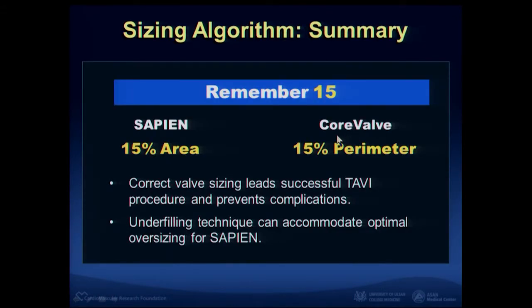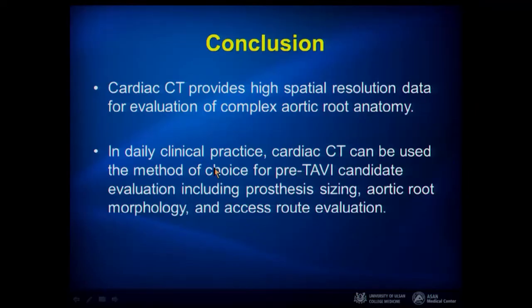This slide shows a summary of the sizing algorithm in our institution. Our cardiologists are using the 15% rule in both the SAPIEN and CoreValve systems, and cardiac CT is applied to prosthesis sizing in clinical routine practice.